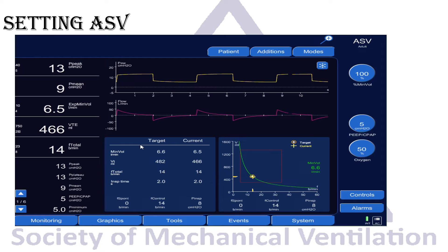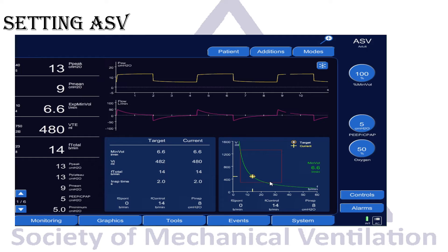With these settings entered, the ventilator calculates the target minute ventilation — here showing a tidal volume of 482 mL at a respiratory rate of 14, with an inspiratory time of 2 seconds. The target icon shows what the ventilator is aiming for: tidal volume around 480 mL and respiratory rate 14. The ventilator continuously adjusts to keep the patient on that optimal curve — either low respiratory rate with high tidal volume, or high respiratory rate with low tidal volume — within the safe zone for ventilation.